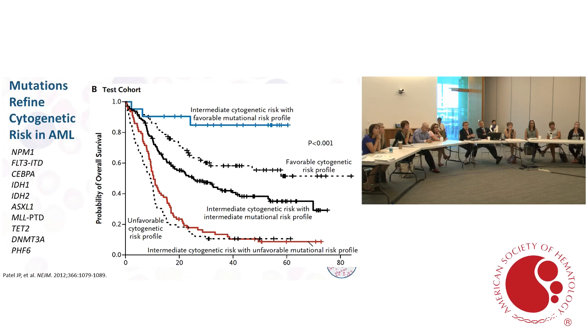There's additional material on the top of chromosome 6 that can't be identified. If they can identify the rest of the chromosome, they'll put it where they think it should go. Otherwise, it would be listed at the end as a marker, an unknown chromosome. So this is described as ADD, additional material, additio in Latin. You've got the loss of 7, the loss of chromosome 13.